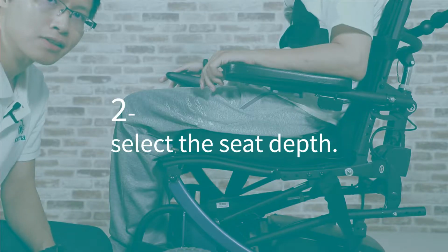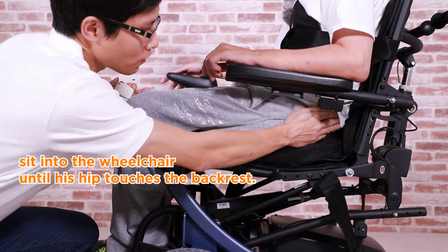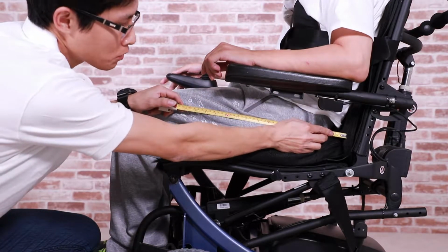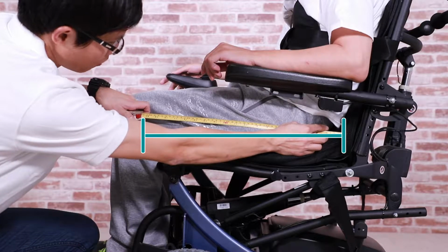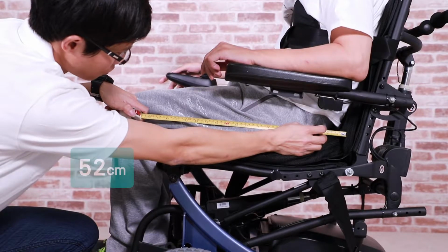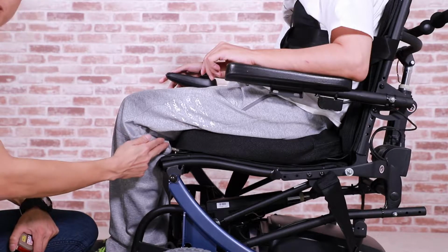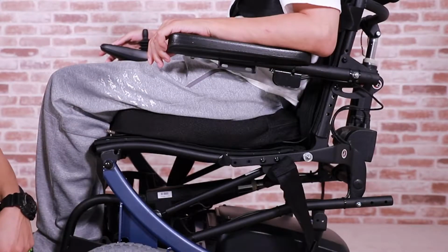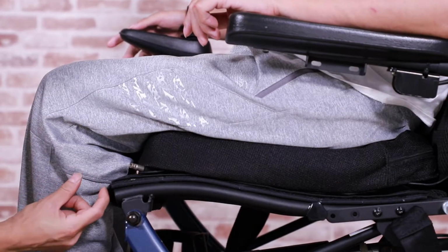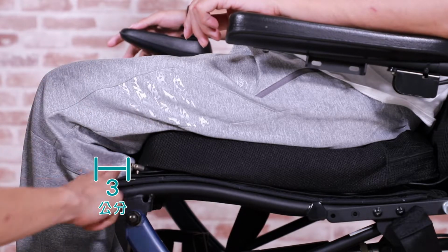Secondly, we need to select the seat depth. First, ask the user to sit into the wheelchair until his hip touches the backrest. Now, we measure the length of the thigh, from the back of the hip to the back of the knee. From this, we find that Mr. Zhang's dimension is 52 centimeters. Generally, we want to avoid friction between the back of the knee and the seat cushion. This friction might cause circulation problems. Therefore, we reduce 3 centimeters from what we've measured. 3 centimeters is actually about 2 fingers wide.